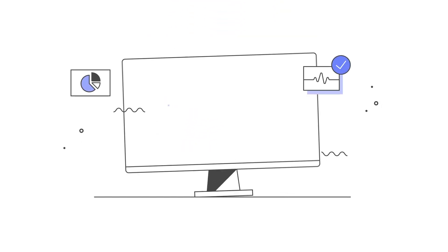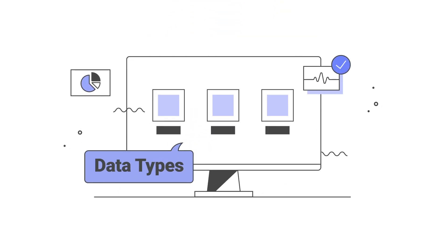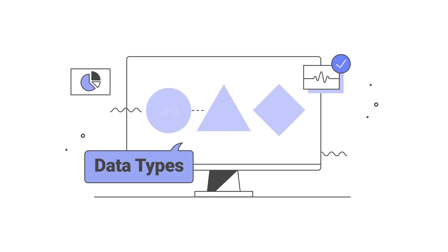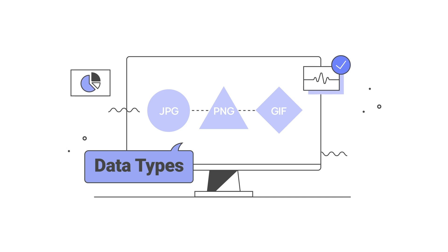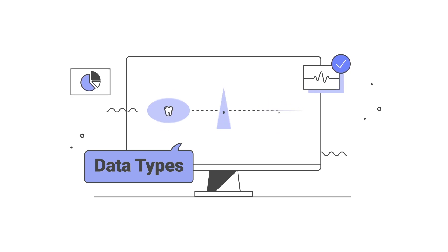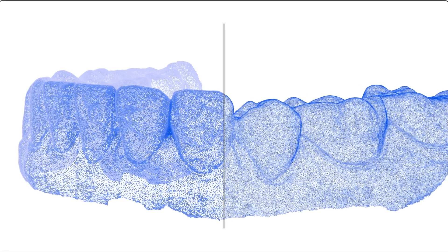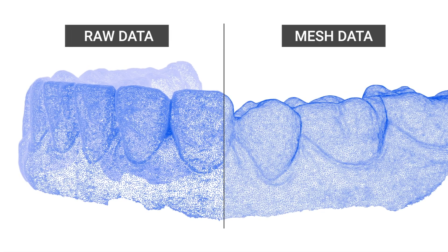Now we'll look at the types of scan data saved in MeditLink. Scan data has various file types like images: jpg, png, gif, etc. In MeditLink, you'll see two types of scan data: raw data and MeditMesh data.